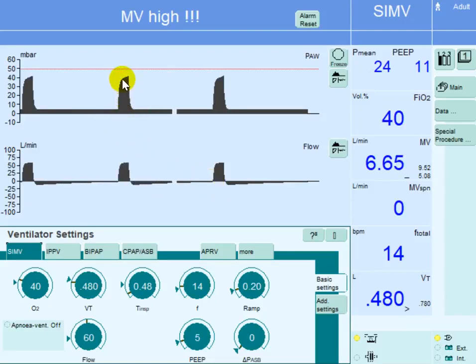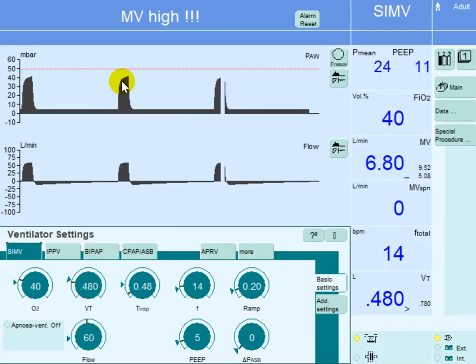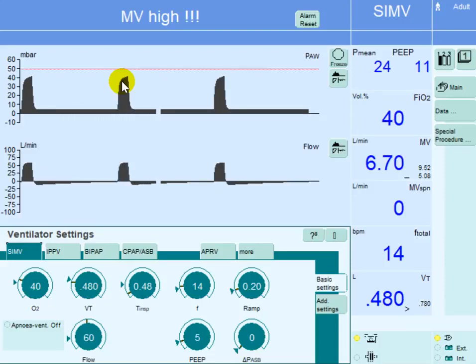Notice that the peak inspiratory pressure has increased, but this is not the plateau pressure. The peak inspiratory pressure may not have much effect on the lungs in terms of barotrauma, so I would not be very concerned about it at this point. We've now gone through the different maneuvers that aim to increase the expiratory time to improve dynamic hyperinflation syndrome. In addition to all those maneuvers, the patient is also on beta-2 agonist bronchodilators and steroids to treat his severe asthma.